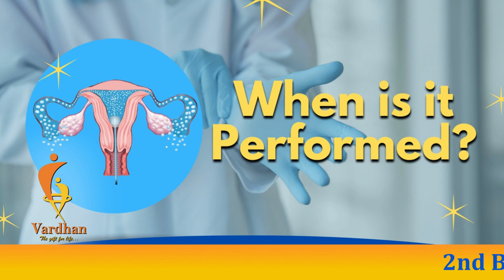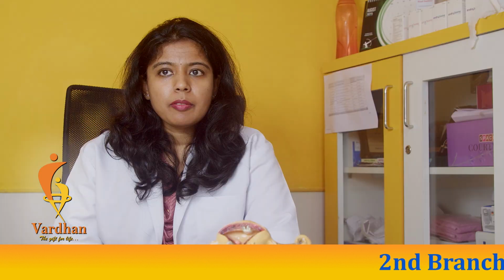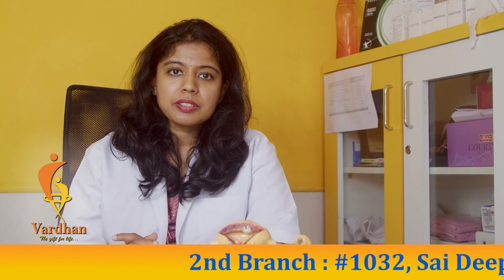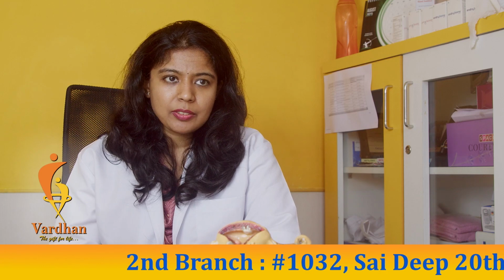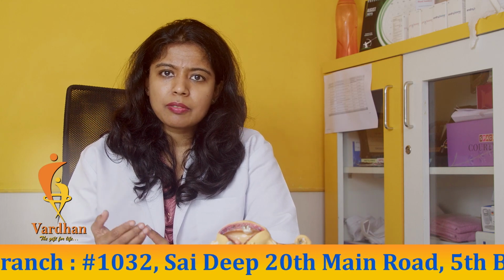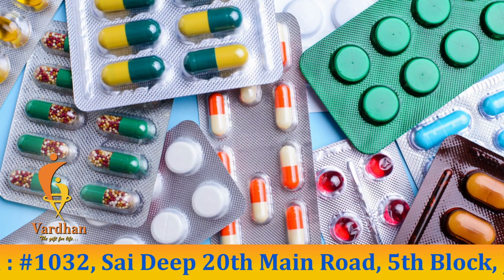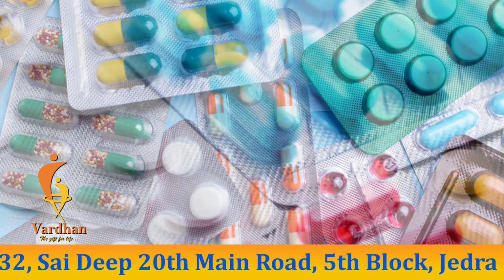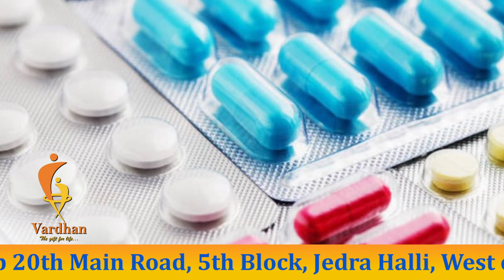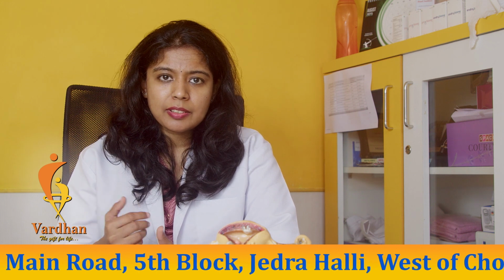When is it performed? When a patient comes to a fertility clinic, we do not directly jump to giving her a tube test or HSG procedure. Initially, we check her, we do an ultrasound, we do hormonal evaluation, and if the patient is young, we give her a trial for 1 or 2 months. We give her tablets to induce ovulation, and if she doesn't conceive after 1 or 2 months, then we suspect that maybe there is some problem with the tubes, and we advise HSG.